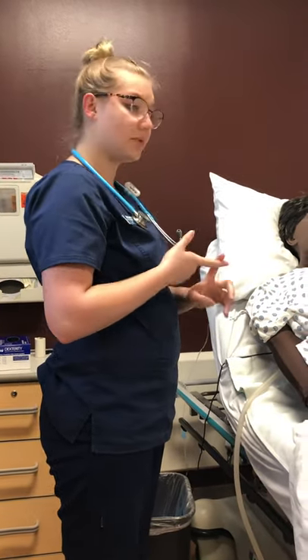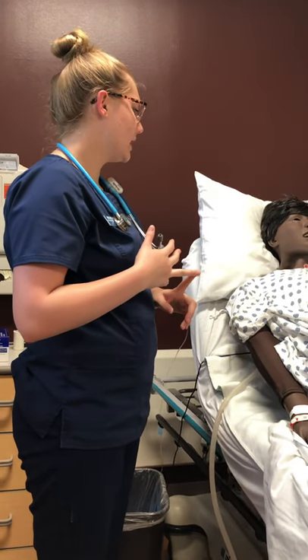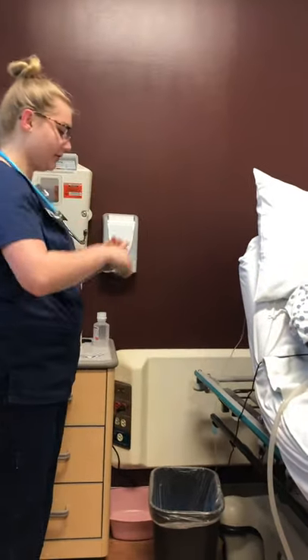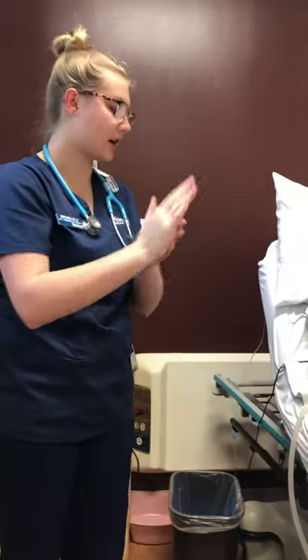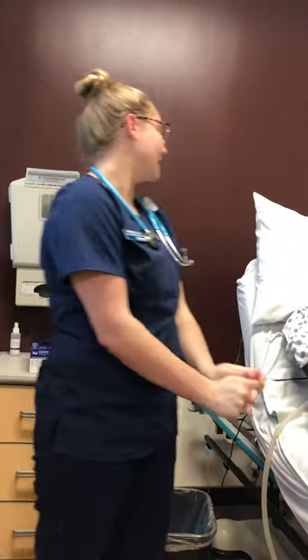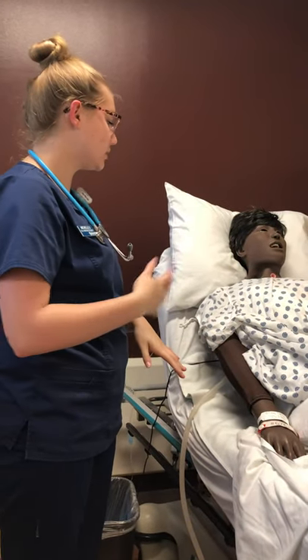I want to document any assessment findings, any deviations from the norm, the time of that, and my initials. I'd want to wash my hands before I leave the room and dispose of anything in the proper area if I were to change any dressings. I'd want to make sure that Mary is safe, the call light is within reach, the bed is low, and she's comfortable.